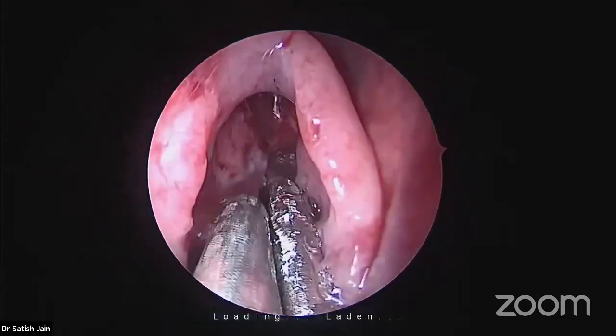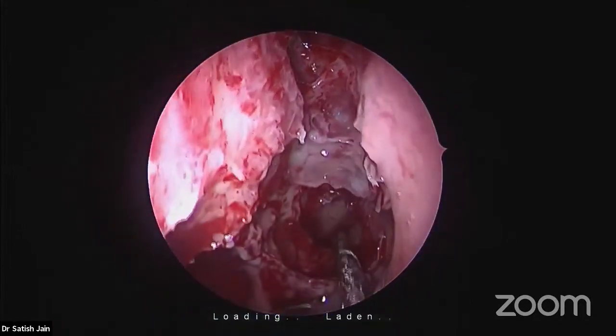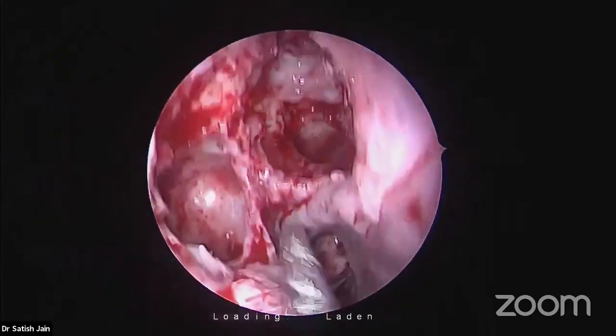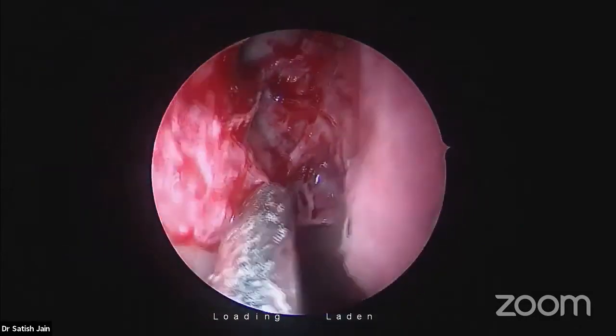Sir, could you tell conditions in which you at times would like to cut the partial part of middle turbinate? Many a time. Huge AFRS. Massive mucosal disease, we do it intentionally. Okay, for better delivery of steroid. Yes. No question of blocking it further.